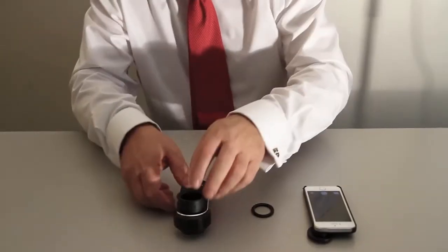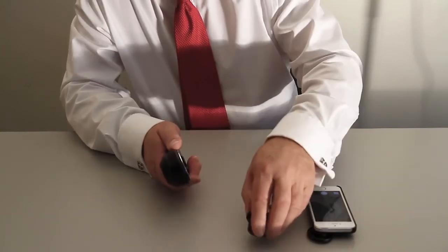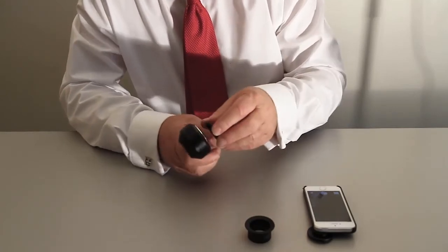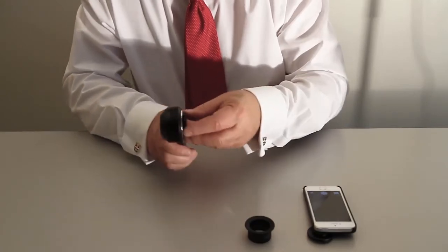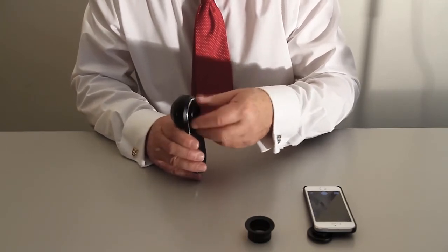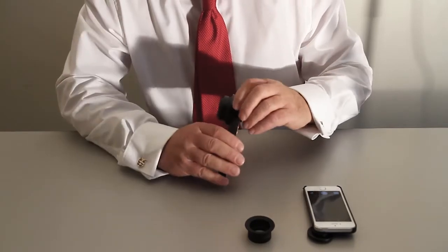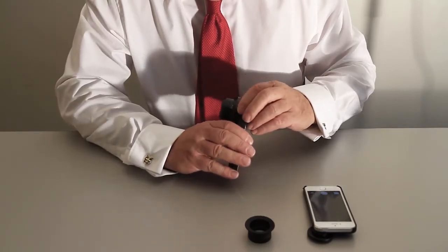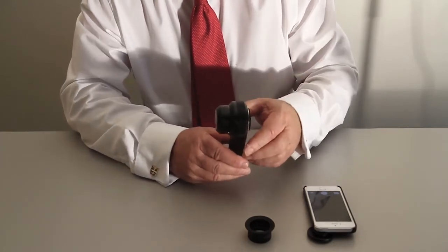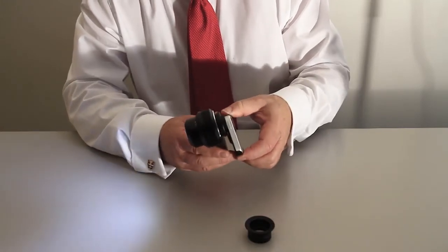With the DermLite 3, the first thing to do is just unscrew the eyepiece and put that aside. Then onto the same threads, you get the magnetic ring, and with the magnetic face out, you screw that onto the DermLite. Make sure it's done up nice and tight. At this point, you can always adjust the focus a little on the DermLite. And then once it's turned on, you can then click it into place with the sleeve. So your iPhone is now attached.